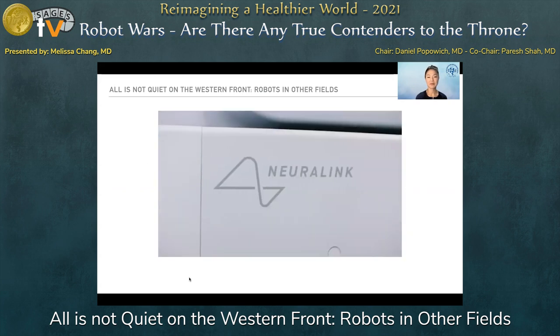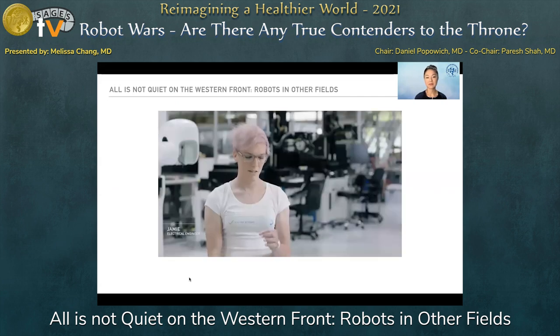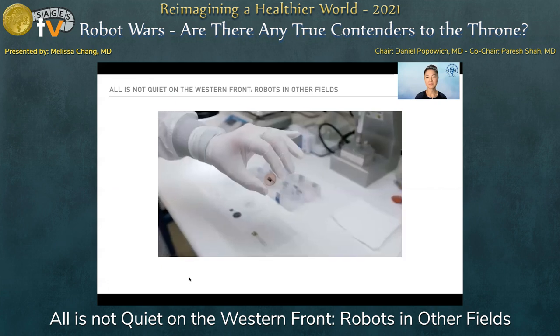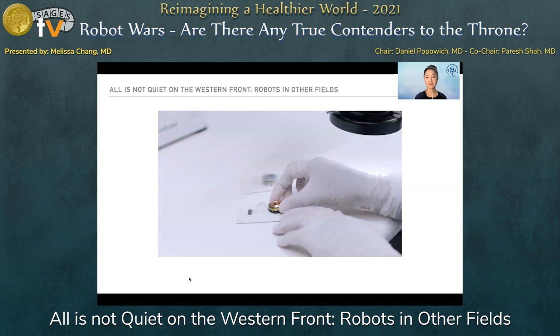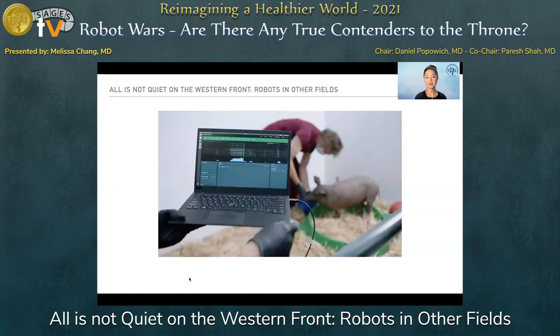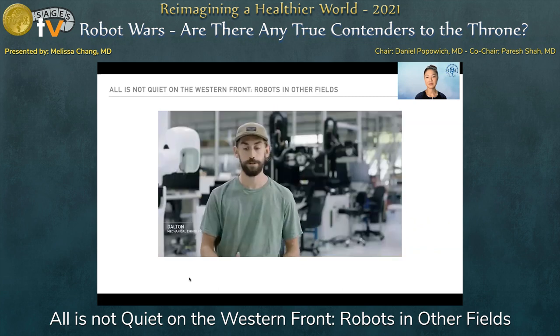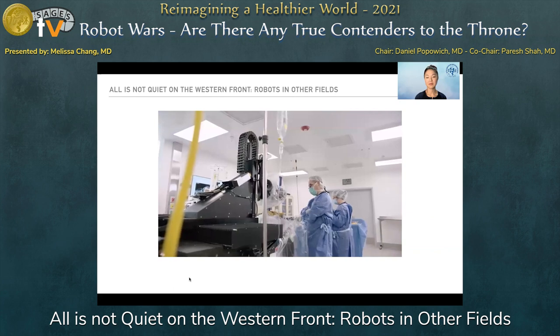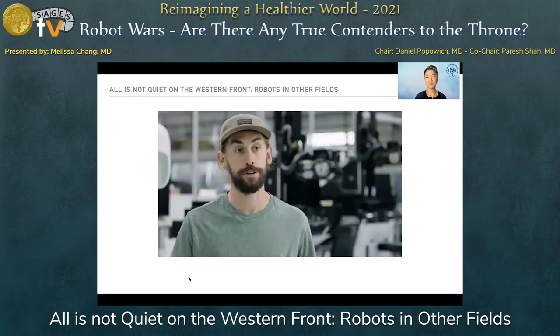And like most immediate need for a robot is to be able to manipulate these threads and insert them into the brain. So the implant is kind of like this little puck of the secret sauce active electronics, and the electrodes are these tiny little flexible threads that each at the very end have multiple little electrodes that if you get those electrodes next to a neuron, they can record what that neuron is doing. The nature of the device that we're implanting and the way that we're implanting it allows for minimal reaction of the brain tissue to our device to increase the lifetime.